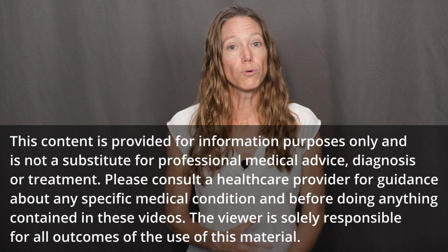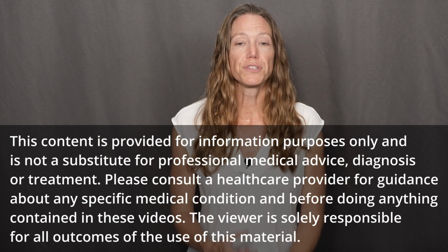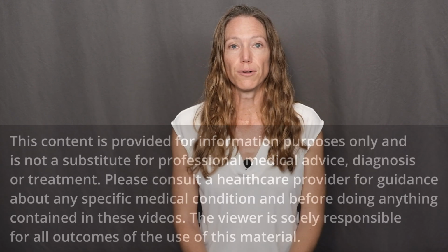It limits motion or completely immobilizes that area. It also decreases muscle activation in that area, which allows injured muscles to heal. Some braces also provide compression, which will help decrease inflammation. Overall, a brace is a temporary tool to help you perform your daily activities while allowing the affected tissues to heal. So in the wrist, this could include a severe sprain, or it might involve carpal tunnel syndrome or other type of injury to the tissues in the wrist.